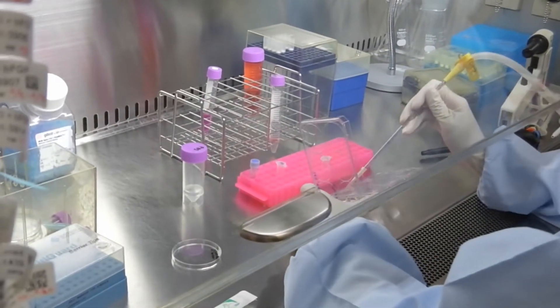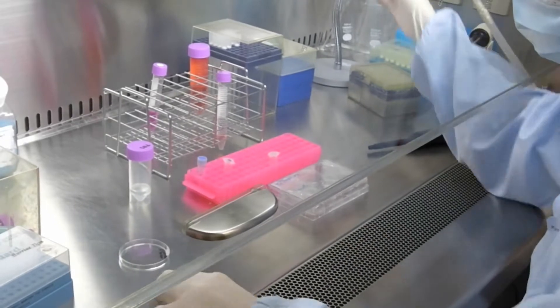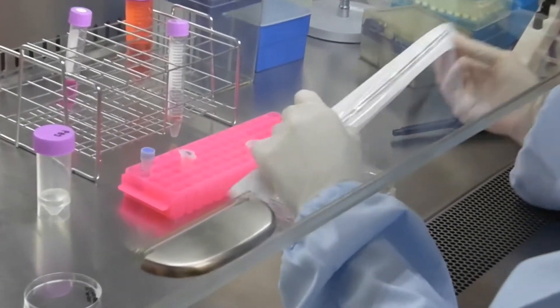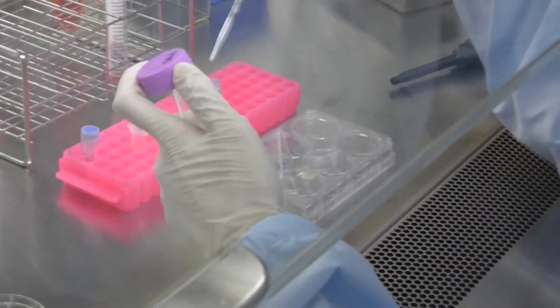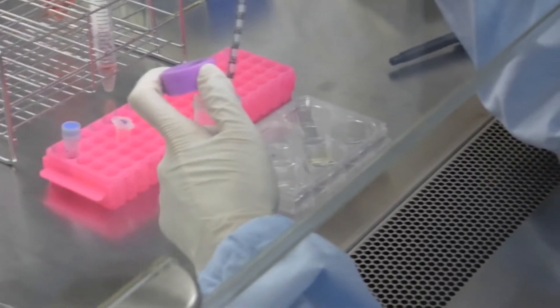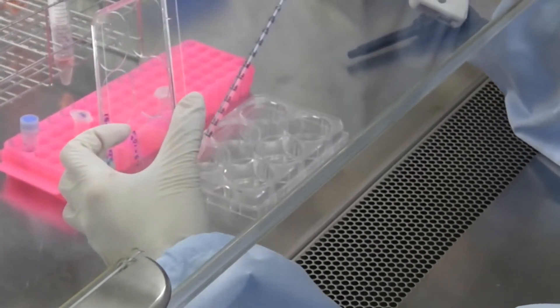Remove the medium from the wells where the iPS cells have been cultured using an aspirator. Wash the well with 1 mL of PBS and remove the PBS with an aspirator.